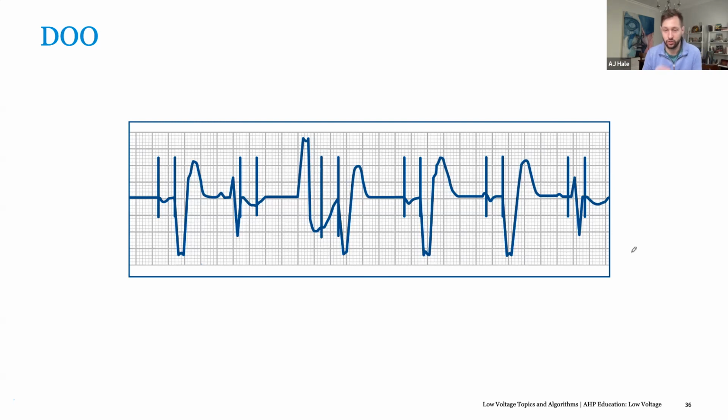I think that having just one electrode in the atrium is not ideal. If down the road they ever created one that had your ventricular electrode and a couple of different atrial electrodes, kind of like what we see with an IS4, that'd be nice. But honestly, we're seeing leaded devices going by the wayside within the next decade or two. I think there's still going to be a future for them, but companies are investing more in leadless technology, so we're going to see less innovation. I could be wrong. Don't get me wrong. I don't know what all the other companies are doing, but it does have its advantages. We just don't personally make one, so I really can't speak to them all because I haven't read the talk tracks on it.